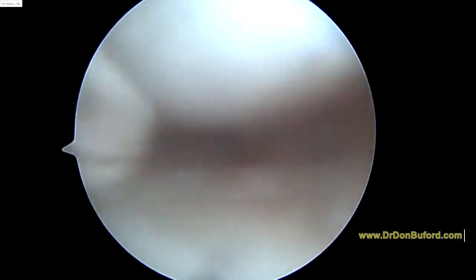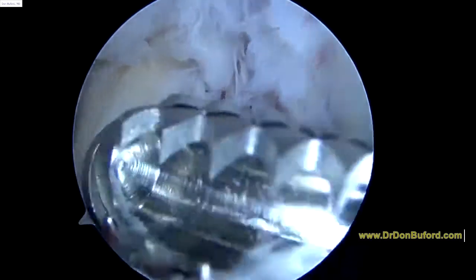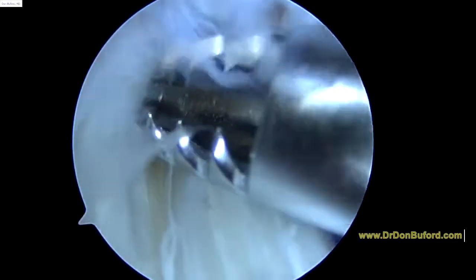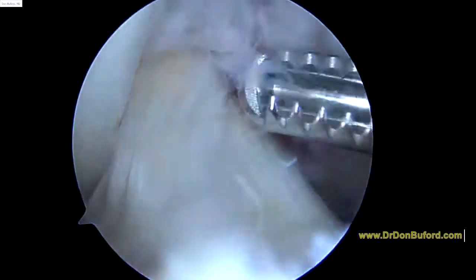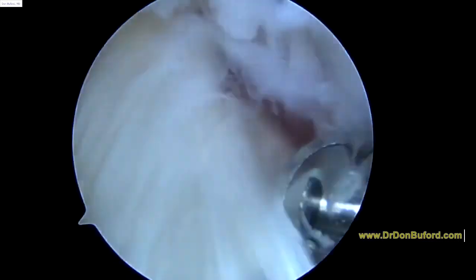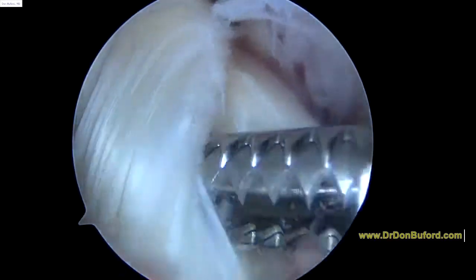We'll keep working on the trough some more in a minute. Looking at the ACL — your knee was not unstable. You can see you've got some wear and tear changes in it, maybe a little bit of an inline split in this anterior bundle. But not bad — it's intact. The knee wasn't unstable. Just under the magnification of the arthroscope, you can see the anatomy a little bit better.